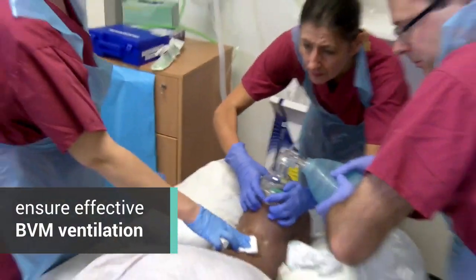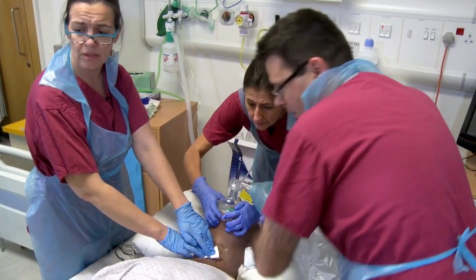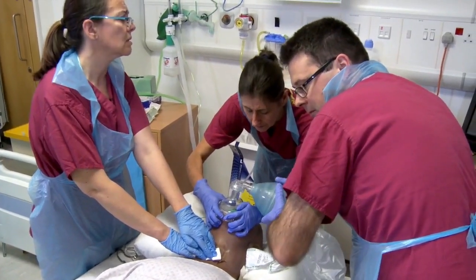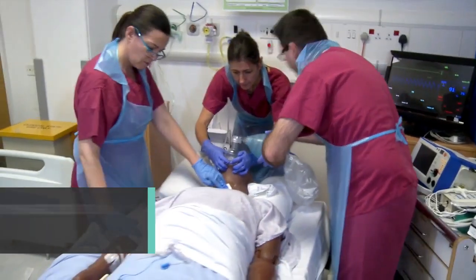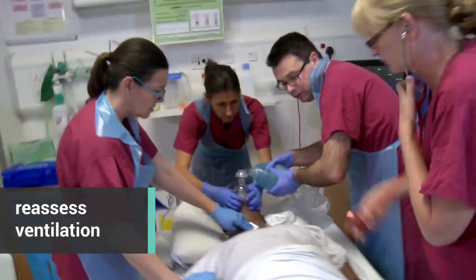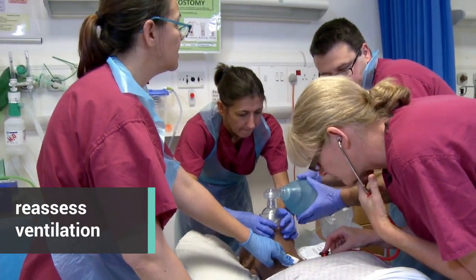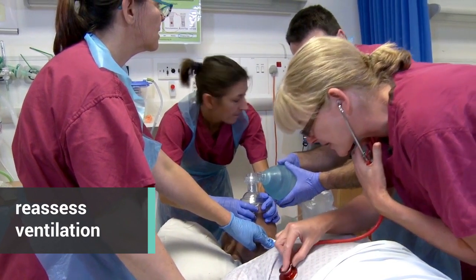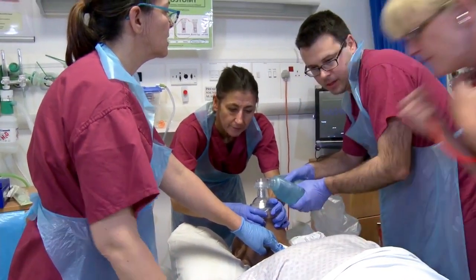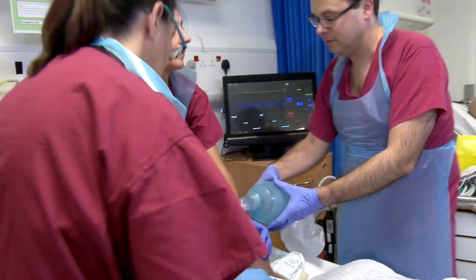Sats are still 83, 84. Are we getting a stethoscope? There's a stethoscope on there — okay, let's go. We are ventilating. Sats are 91. Robert — 92. It's entered bilaterally. 93. Okay, there we go. All right, Robert.